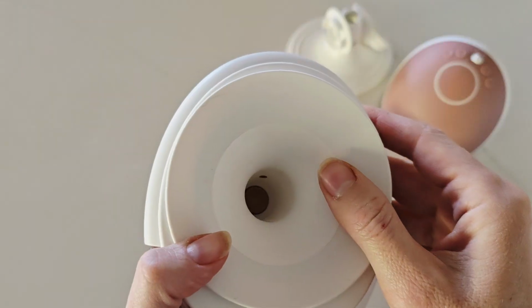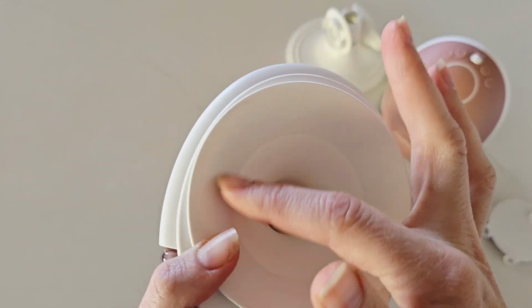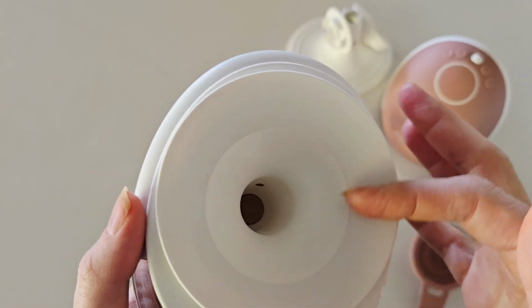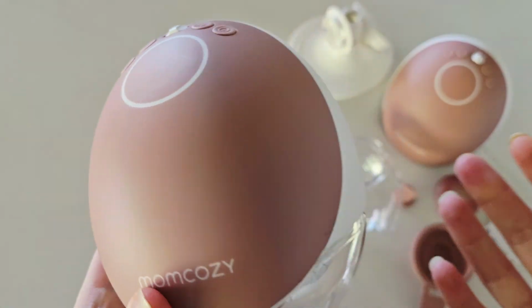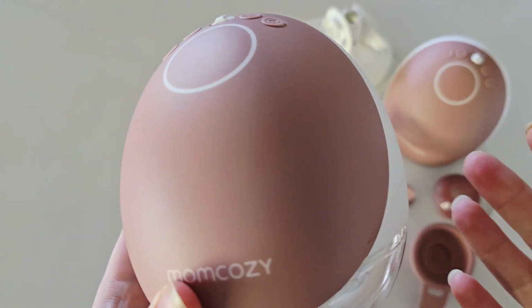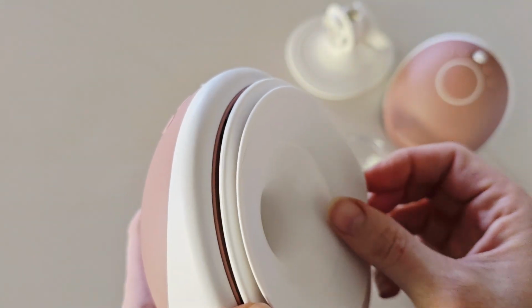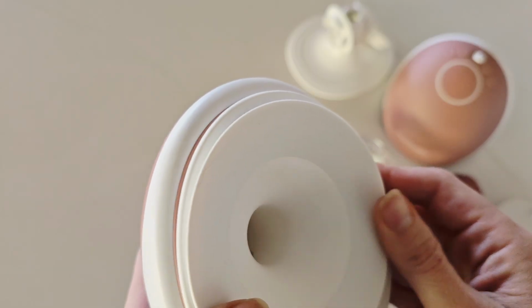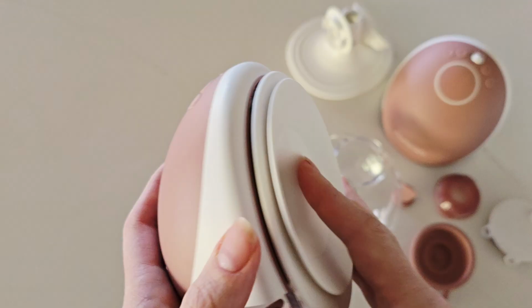Over time, these parts can stretch and loosen and create little pockets for air to be drawn in, which reduces your overall suction. Again, you might find that you start having a few leaks and your pump's not holding your breast milk as it did previously. That can be, again, just the parts. A lot of these are silicone, just stretching and wearing over time, creating little areas where the milk can leak out.